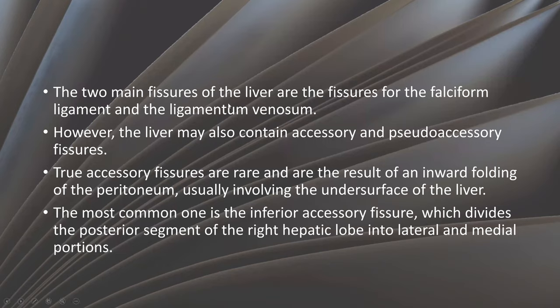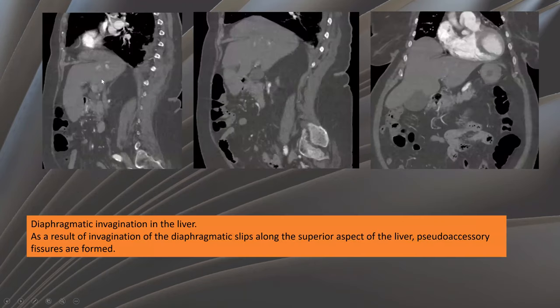The liver has two fissures — the falciform and ligamentum venosum — and may also contain accessory or pseudo-accessory fissures. However, true accessory fissures are rare, and the most common important one is the inferior accessory fissure, which divides the posterior segment of the right lobe into medial and lateral portions. Here, a patient with pseudo-accessory fissure due to invagination of the diaphragm into the superior aspect of the liver is seen on coronal and sagittal reformatted images.